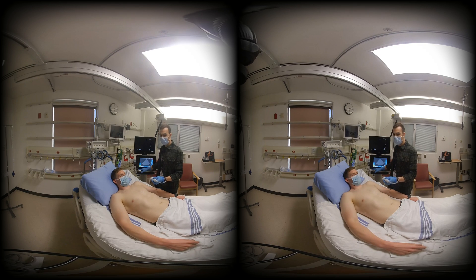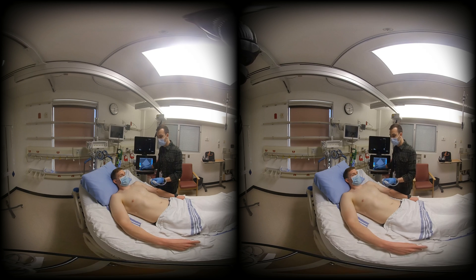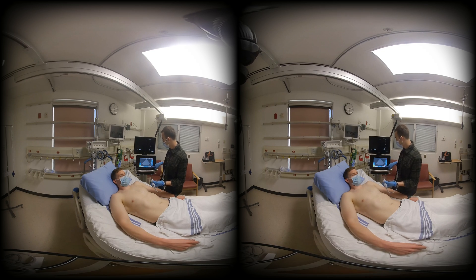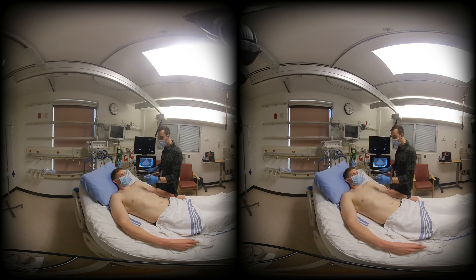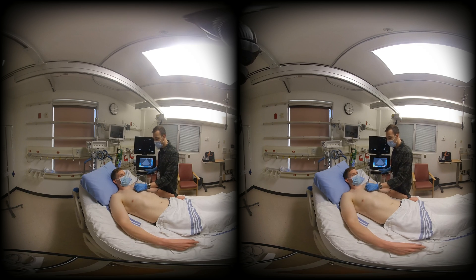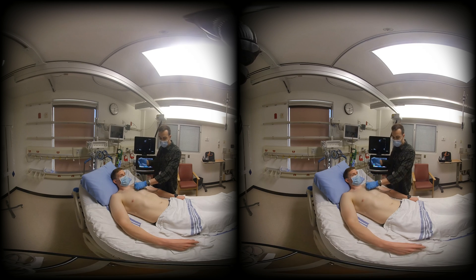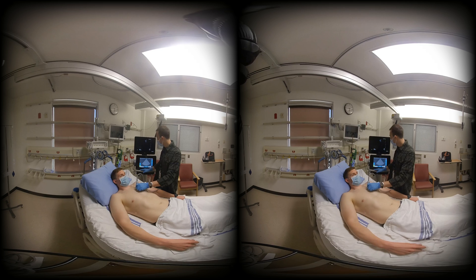When assessing a patient with shock in the ICU using echo, it's important to have a standardized approach that's somewhat congruent from patient to patient. The first view we're going to start with by convention is the parasternal long axis view. We're going to start off with generous depth selected on the machine, which can be changed using this slider on the left side of the screen. I'm going to start at about 23 centimeters and put my transducer down on the patient's chest with the probe marker angulated towards his right shoulder, starting fairly high in the chest at roughly the second intercostal space, angulated downwards towards his hips. I'm going to slide down one rib space at a time until cardiac structures come into view.